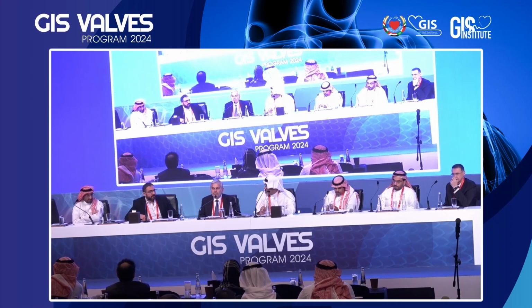So I think it depends on the pathology. Sometimes you have type 0 bicuspid with predominant aortic regurgitation. In these cases, I prefer balloon expandable if they don't have too much calcium. And if the pathology is calcification and stenosis, I prefer self-expandable platforms with predilatation.